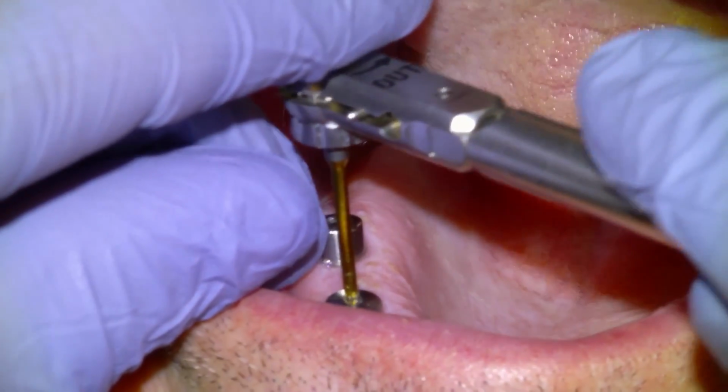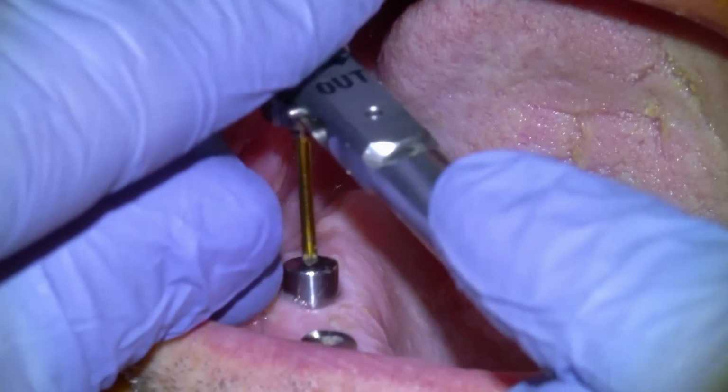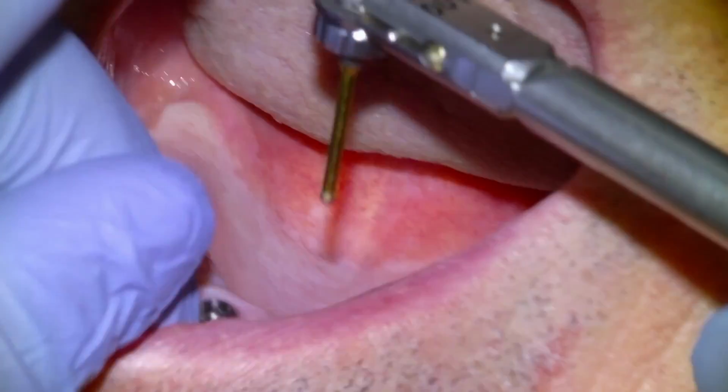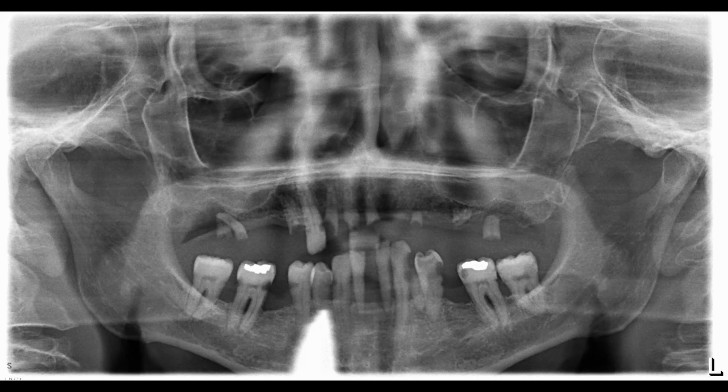Hey everyone, Dr. Tanner Dobson, and in this video I'm going to be going over the installation of an all-on-5 dental implant bridge that we did for a patient. Here's a scan that we took when the patient initially presented to the office.